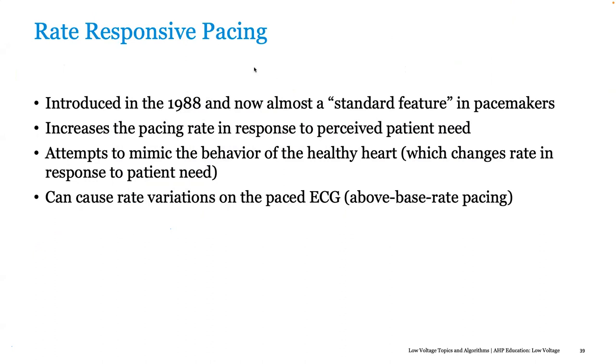Okay. So regarding the intermittent AV block, would you think shortening the AV interval would help at all? Would we want to just see how much intrinsic activity would go in and then just back off the pulses?